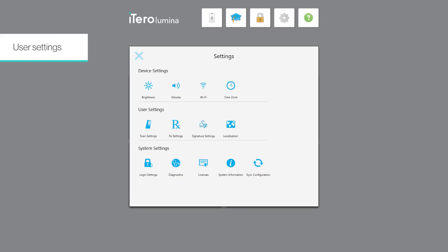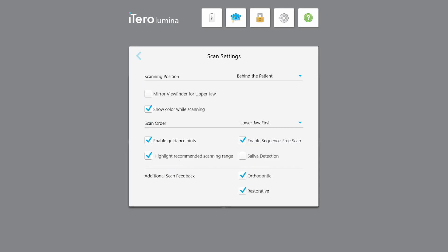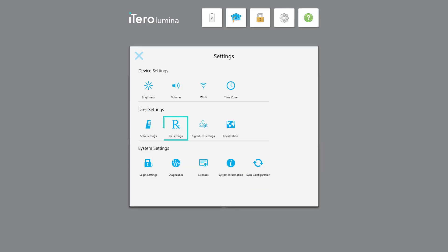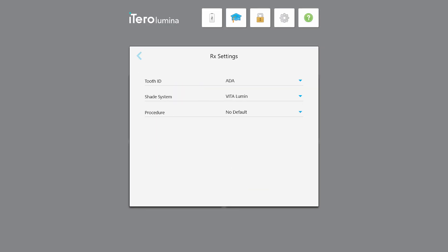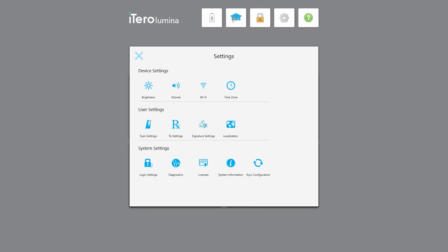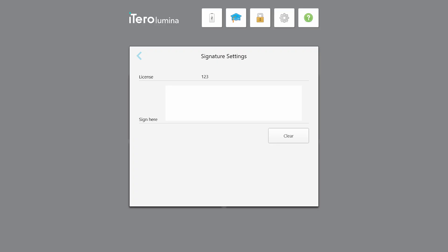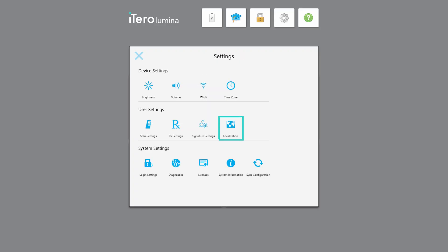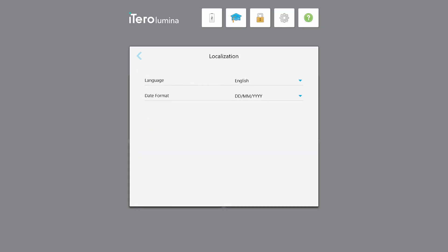In the user settings you can define various scan settings, define the prescription settings, define your signature and license number which are displayed when sending an order to the lab, and select a different language for the scanner.